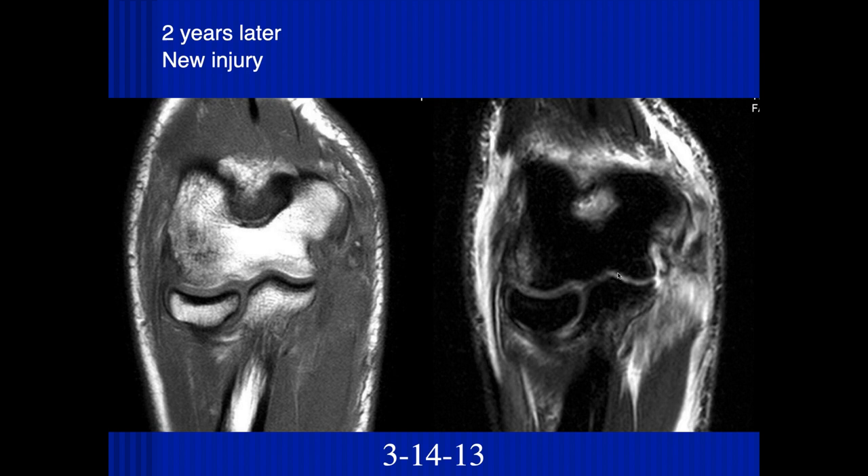Let's see what it looks like two years later. That ulnar collateral ligament now is completely torn and retracted — you can kind of see a fragment there. You can actually see some bony remodeling along the lateral aspect of the humerus — just chronic impaction as they continued to play. Then this patient had another injury: a distal tear of the ulnar collateral ligament and its insertion to the sublime tubercle, a tear of the pronator teres, and a valgus impaction injury.